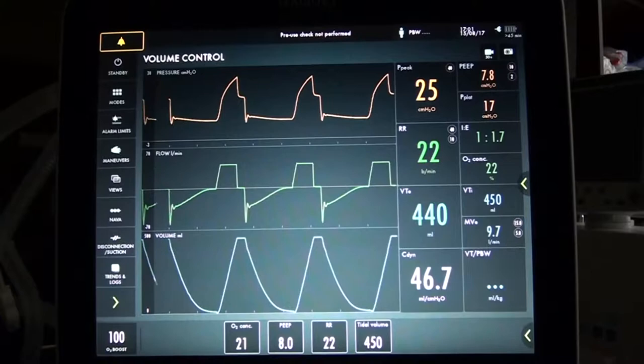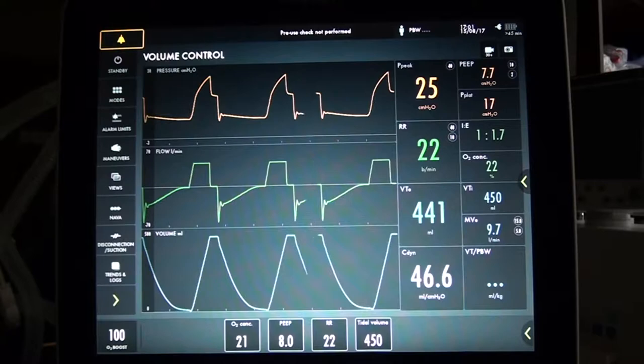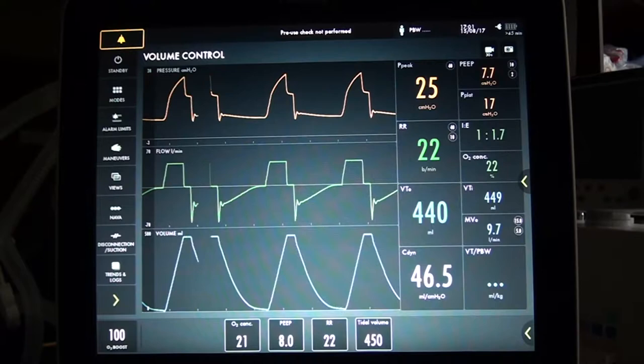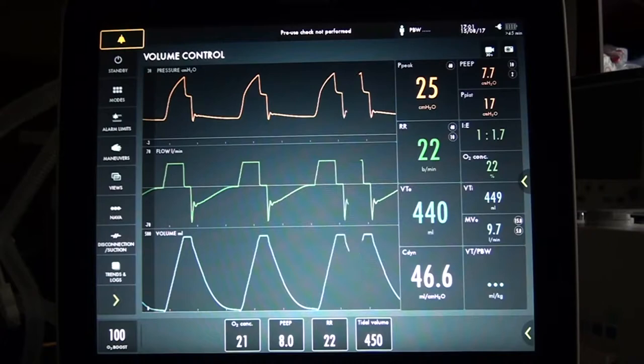Let's have a look at real tracing from a mechanical ventilation — what we can see on the screen of a ventilator. This is a tracing of a patient on volume control ventilation. From top to bottom you see the airway pressure, the flow delivered by the ventilator, the expired flow from the patient, and the volume.